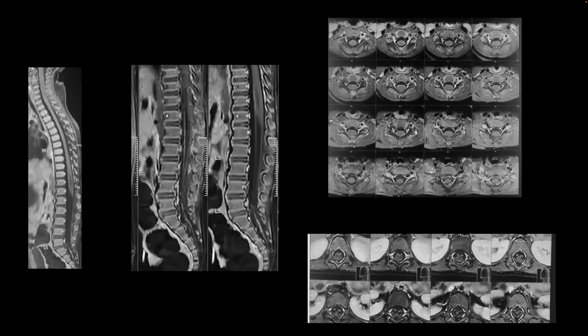Post contrast was done. The cervical lesions did not demonstrate any enhancement, but there was some degree of cauda equina nerve root enhancement. You can appreciate on the axial sequences here, more ventral nerve roots are demonstrating this degree of enhancement. Also on the sides, you can see that there is slight hyperintensity on the post-contrast study.